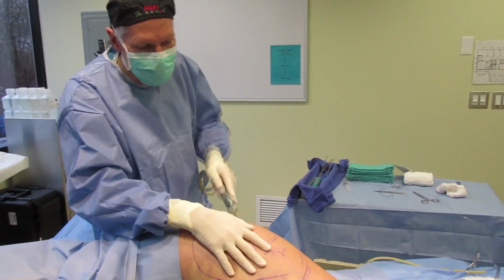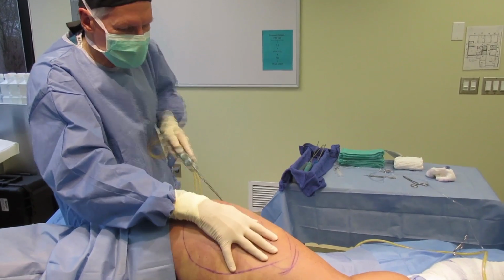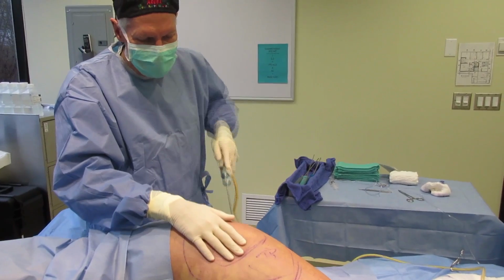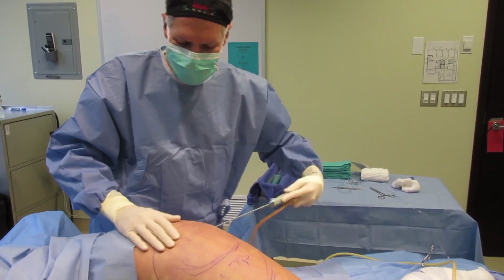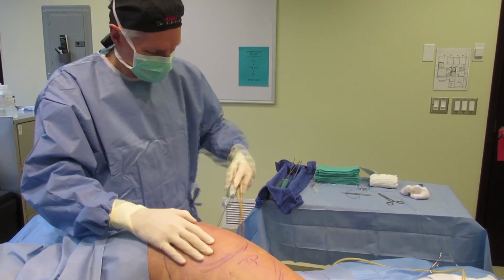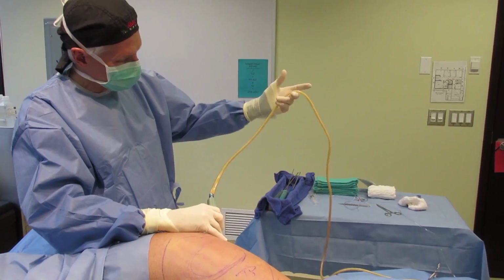These are radial passes. There's very little resistance under her skin with the fat. We're getting a really nice confluent removal of these layers of fat that bother her. And I will be using these holes, different holes for different vectors, and that's how we get a nice smooth result. But you can see that this fat is coming up really nicely. There again, beautiful.